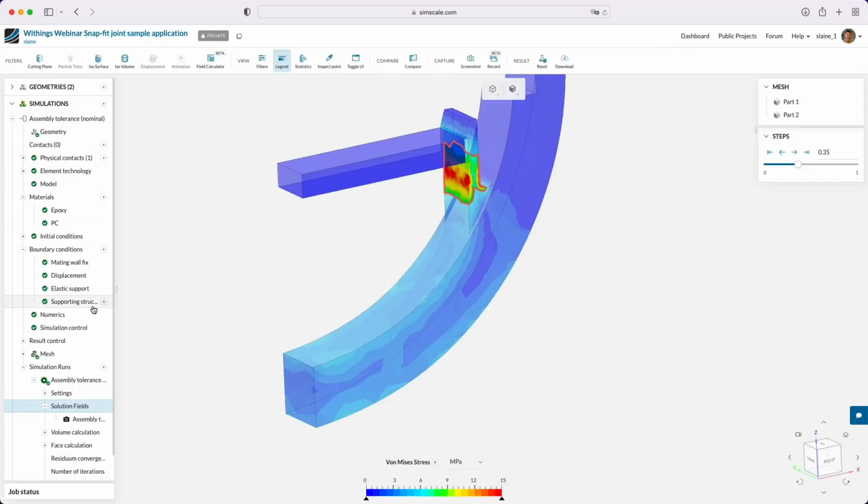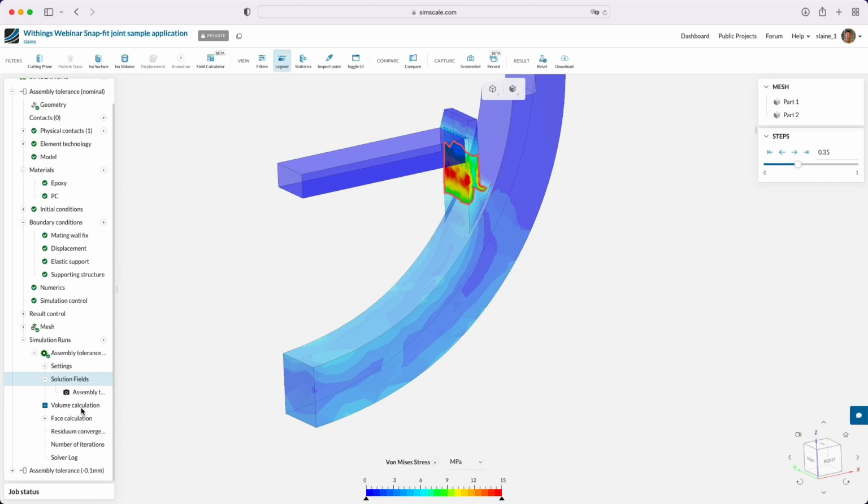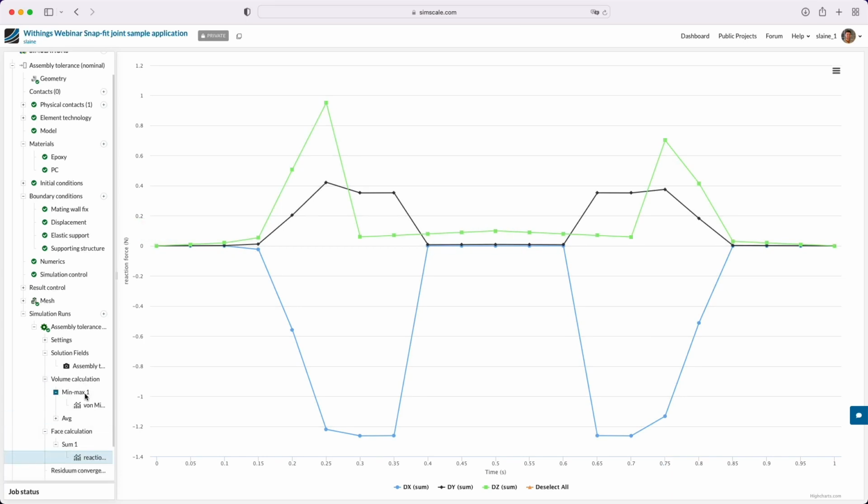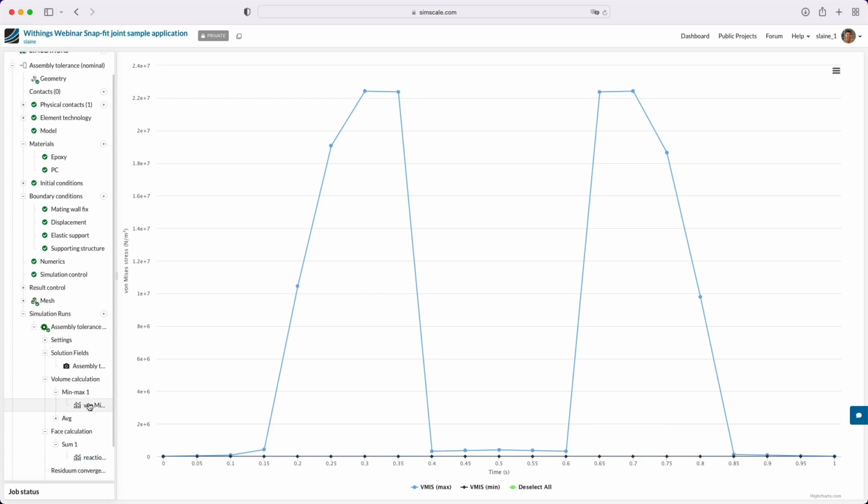Obviously, we can also get some detailed analysis out of here from the face calculations and volume calculation. So we can see what the reaction force is required for this actual snap. So we can see that we've got about 1.2 newtons to connect the parts, and a very similar 1.2 newtons to break the snap apart as well. And we could also analyze the peak stresses that we've got in the part as well.